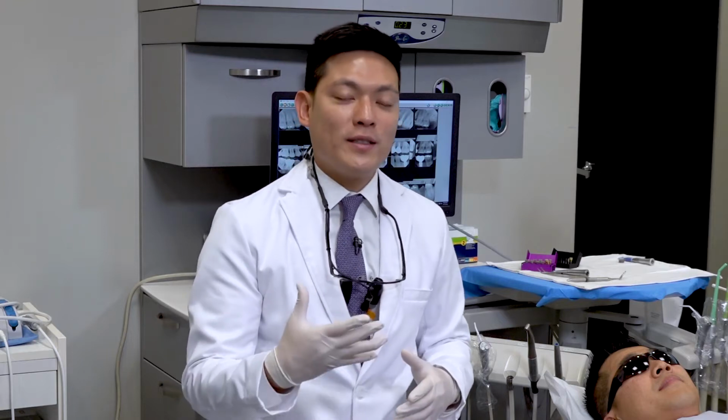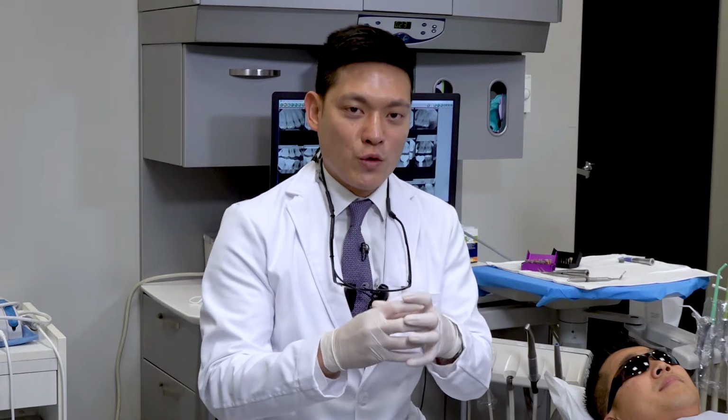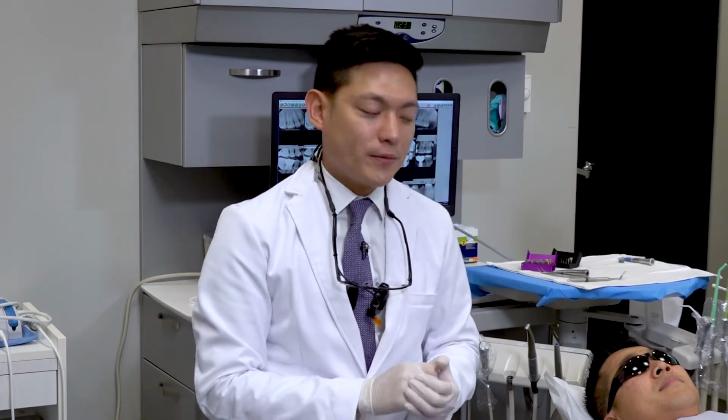Now, we do want to capture those accurately. If the patient's slightly open during the scan, that certainly will throw off the accuracy of the restoration for that area. So again, if they're slightly open, your restoration is going to come out high, which would lead to more adjustments on your end. So we want to make sure that we can design the restorations in the most accurate way by knowing what the true occlusion is for your patient.